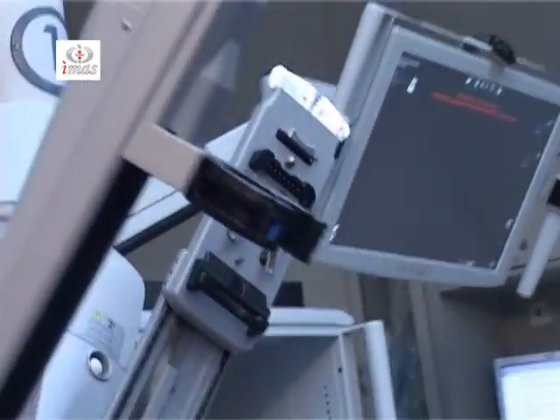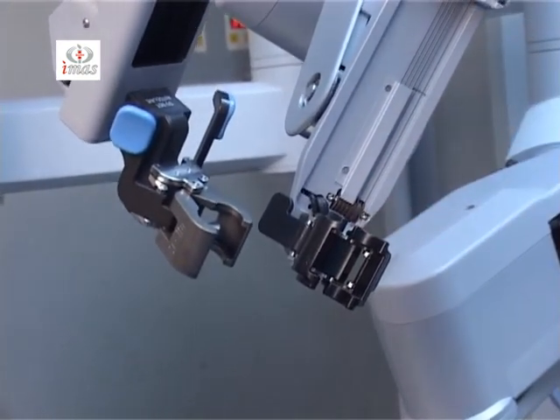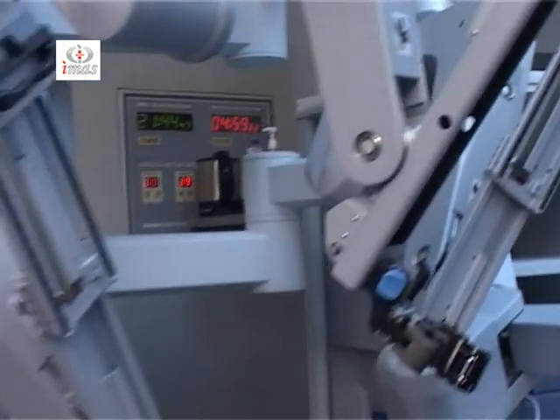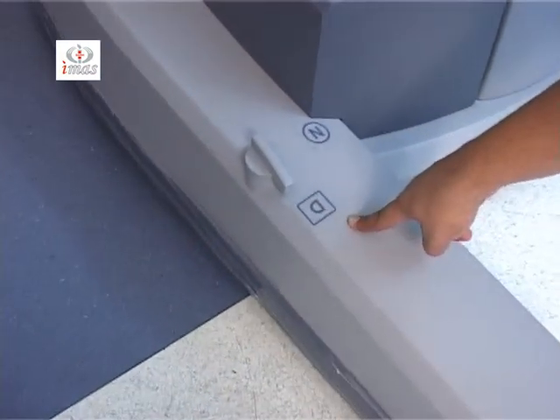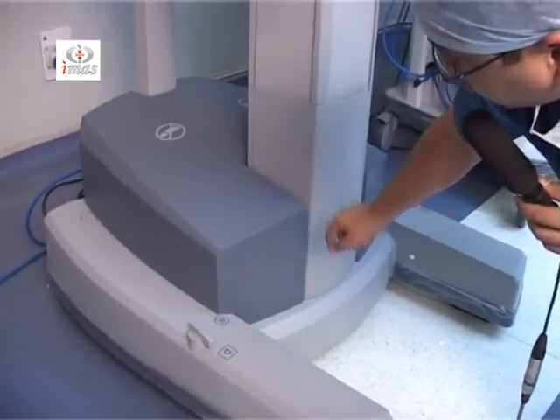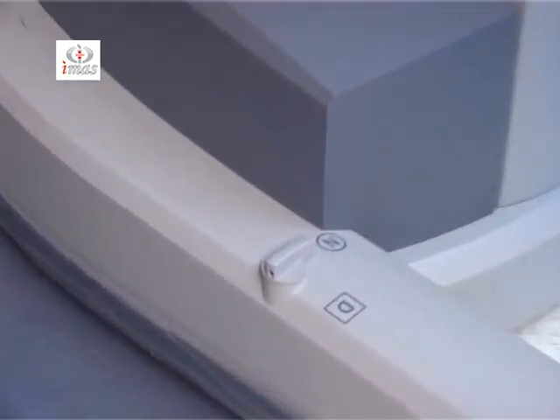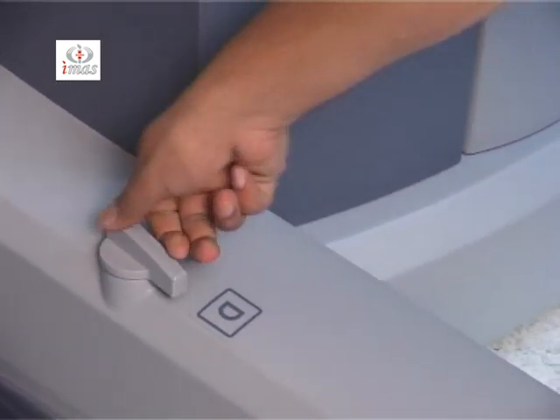These are the quick click cannula mounts. These can be opened and closed and the cannulas can be mounted onto these mounts. And this is the place for the camera arm sterile adapter. These are the shift switches on the patient cart. You can see here there is a drive position in the name of D and a neutral position in the name of N. So if these switches are made to drive position, you can drive the patient cart by motor. And if you switch it to N position, you have to push the patient cart, or otherwise it will not move with the help of the motor inside.